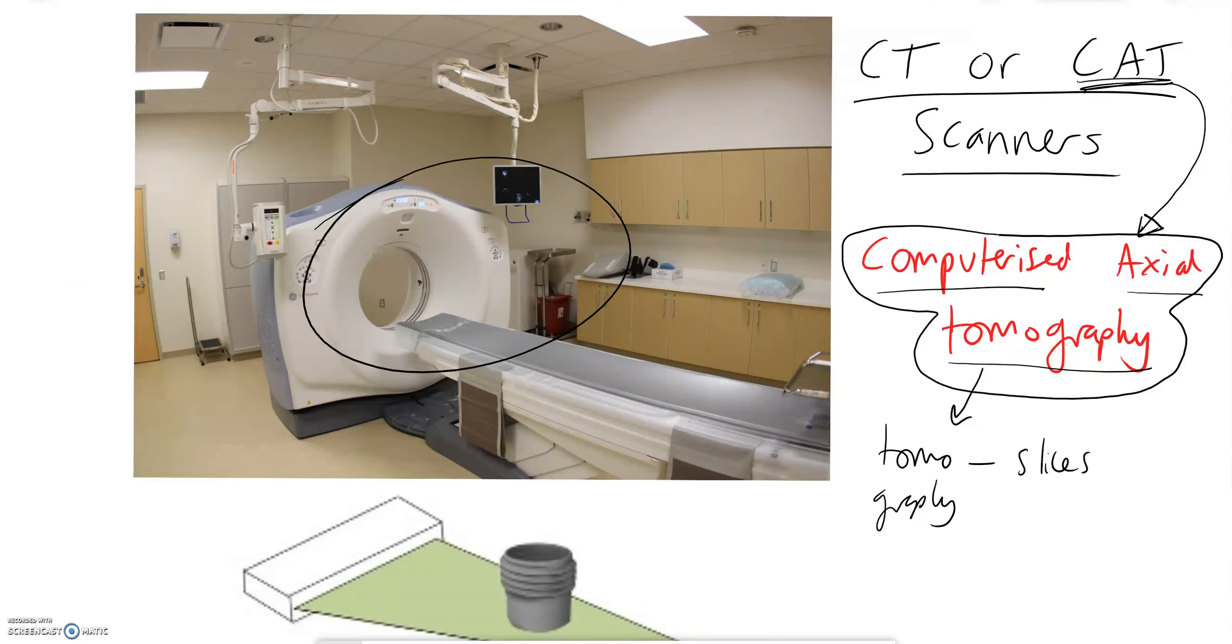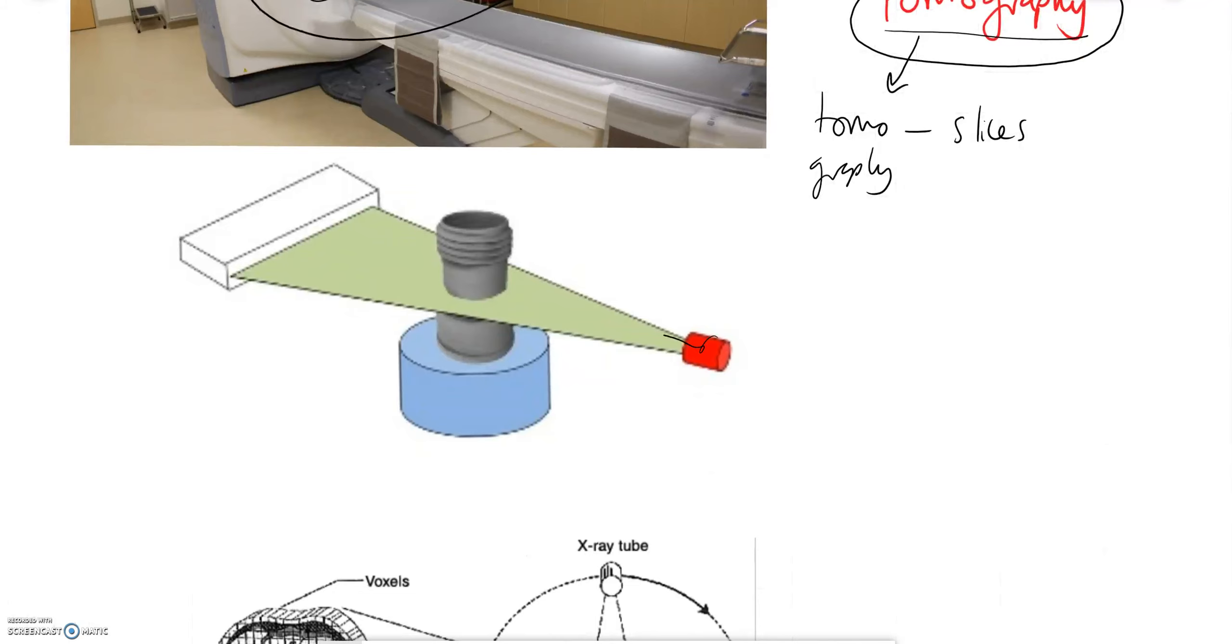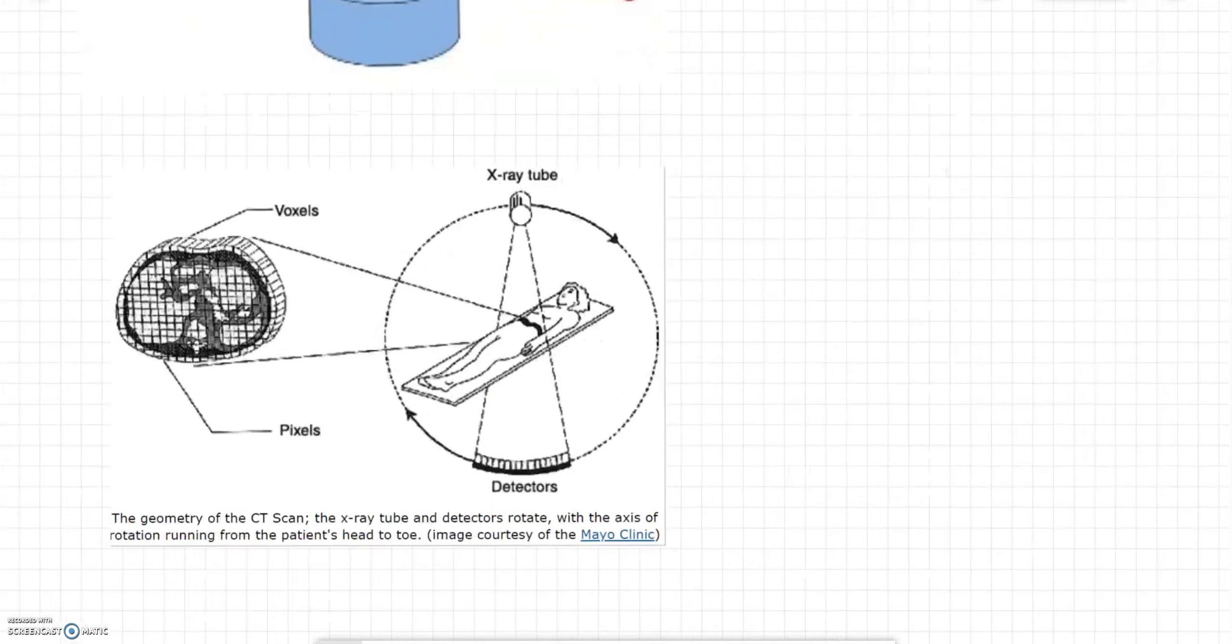What does a CAT scanner look like? Well, it looks like this. And in here is the little x-ray. This uses x-ray CAT scanners. The x-ray goes down and on the other side is the detector, which picks it up. This image shows the x-ray tube, which moves around the patient and the detectors on the other side. And remember, it's scanning it in layers, so it creates images in layers, which is then put together, as you guessed from the name, C for computerized, by a computer. And it takes a lot of processing power because there's lots of images to put together.